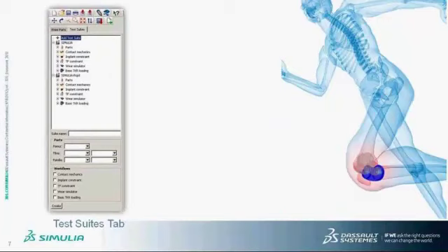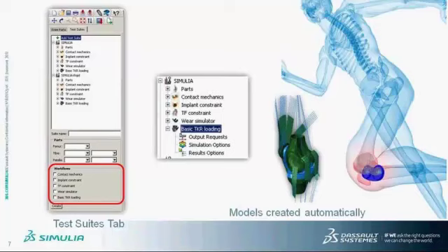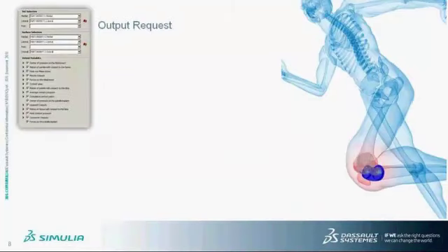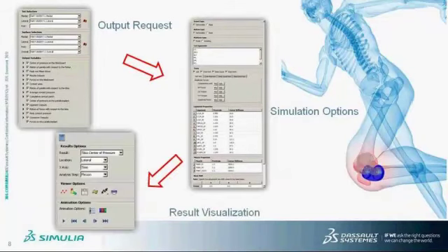The second tab is the Test Suite tab. Here is where the implant components that are imported into Abaqus Knee Simulator are selected to be included in implant evaluation workflows. Once the test suite has been created, all the models for the workflow selected are created automatically. And all the user input requested for the specific workflow is collected in one place. That includes the output request, user specified simulation options. The user can then submit the simulation and visualize the results within the knee simulator.